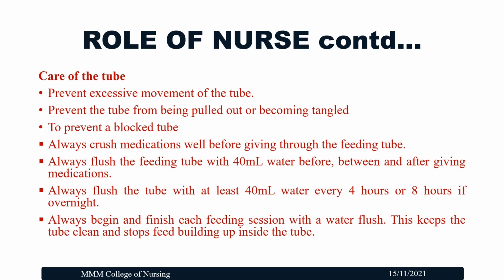Always flush the feeding tube with 40 ml of water before, between and after giving medications. Always flush the tube with at least 40 ml of water every 4 hours, or 8 hours if overnight. This also helps in preventing blockage. Always begin and finish each feeding session with a water flush. This keeps the tube clean and stops feed building up inside the tube.